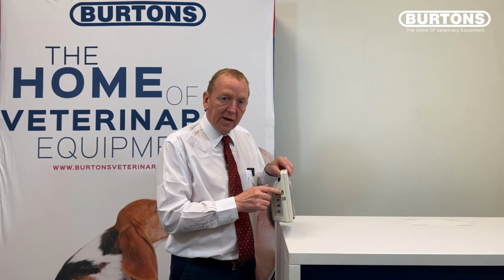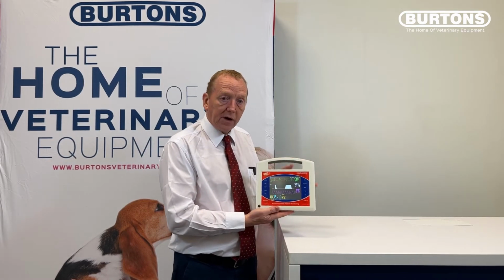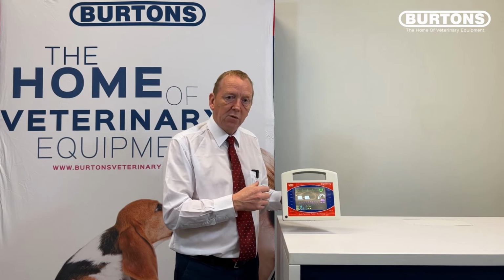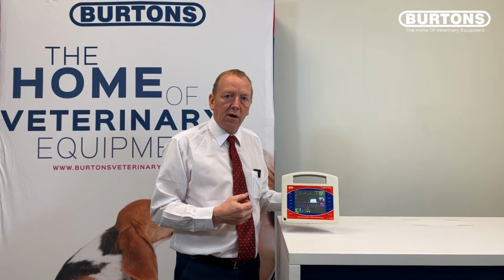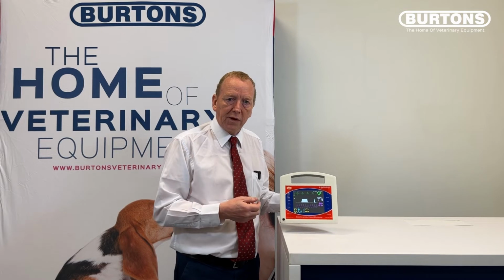The one above is a USB port for a USB stick, and the idea behind that is that the data from the ECG can be recorded onto this USB stick at any point. So placing a USB stick into this port means that during a running of an ECG, we can record that data and then subsequently take it to our analysis software for report writing and printing out.